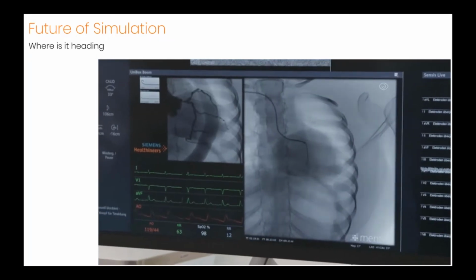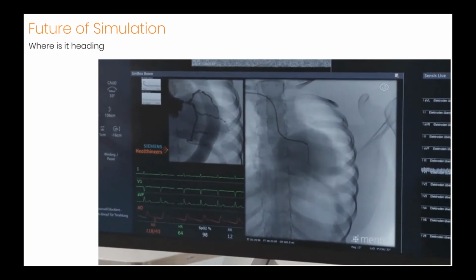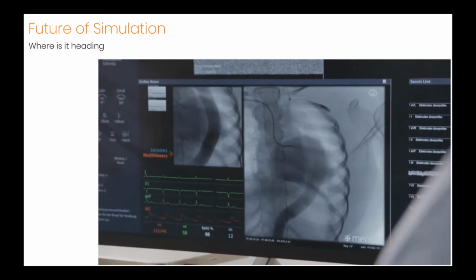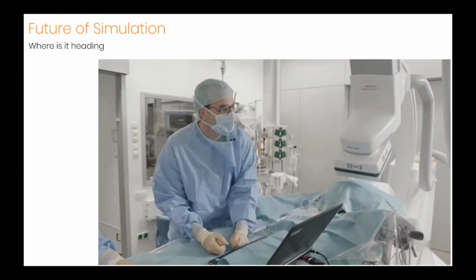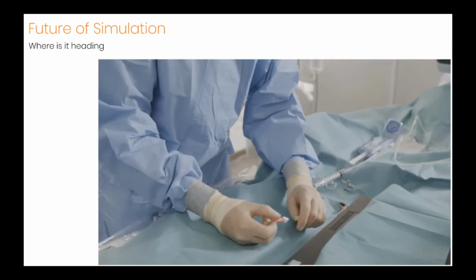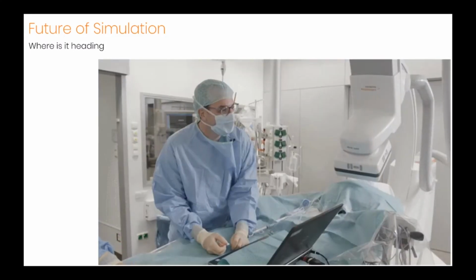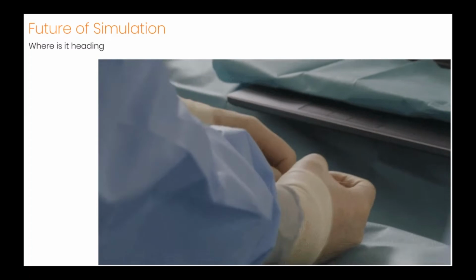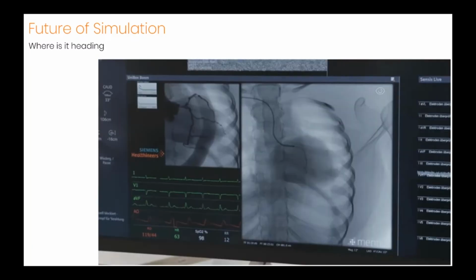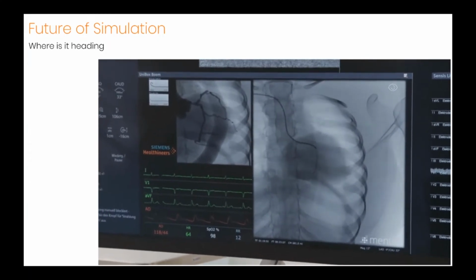The more realistic this type of simulation becomes, the more things it can do. Perhaps it starts giving you hints on sizing, where to go with your wire, and hint at what catheter could gain you the easiest and most secure access. At the least, it could help reduce fluoroscopy time and contrast use, but it could also help gather data from previous procedures all over the world and put that knowledge into your hands. With the advent of robotic solutions, eventually, they won't necessarily be hands at all.